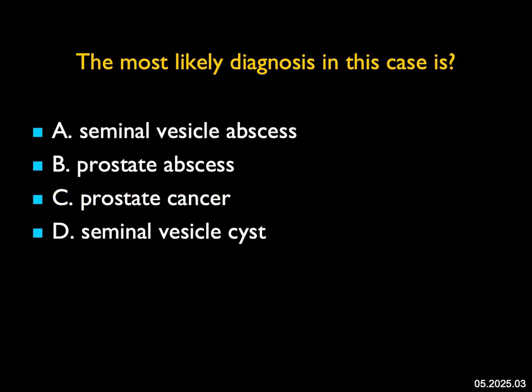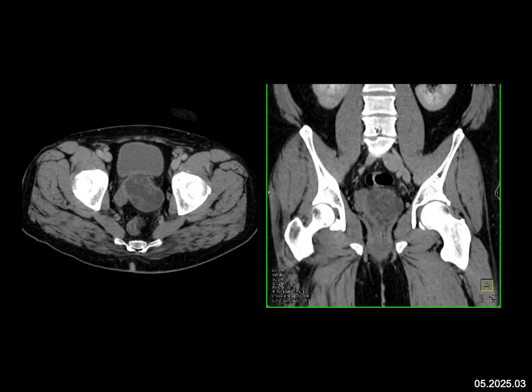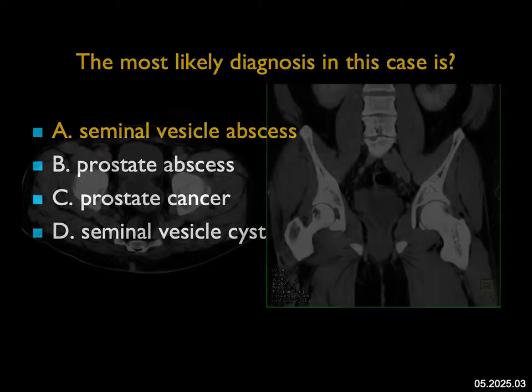The most likely diagnosis in this case: when you look at the pelvis, particularly on the axial images, you see the seminal vesicles with a markedly dilated left seminal vesicle. The prostate itself on the coronals is not very large, but it's this cystic left lesion which is the seminal vesicle. Based on location, this is not a prostate abscess or prostate cancer. Seminal vesicle cysts do occur — it's the right location, but they're typically purely cystic. Here the seminal vesicle is enlarged and inflamed, with soft tissue thickening within it. This is a beautiful example of a seminal vesicle abscess, which is a very unusual cause of pelvic pain.